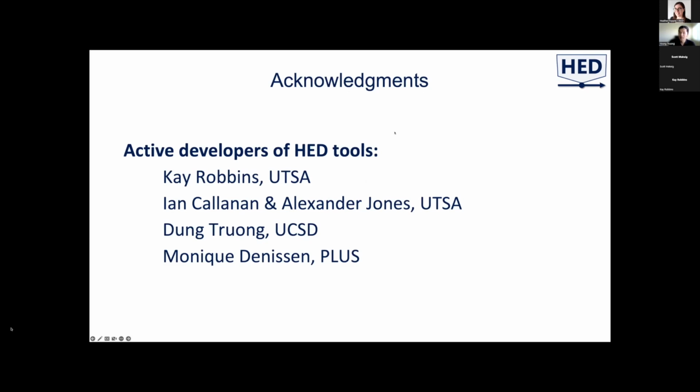I want to mention that the tool is a collaboration of various different people. Kay Robbins and her students at UTSA have contributed tremendously to the process of developing the tools. I mainly maintain the tools that relate to MATLAB and EEGLAB. And then we also had Monique working with us to help with the event restructuring tool, which she'll be presenting next.